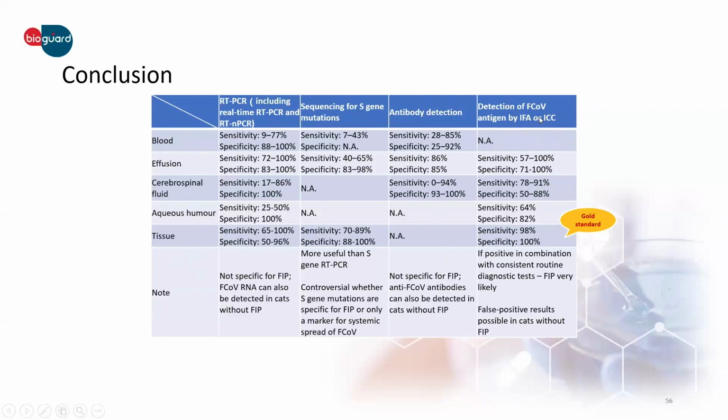And the gold standard, of course, is the immunohistochemistry in the affected tissue.